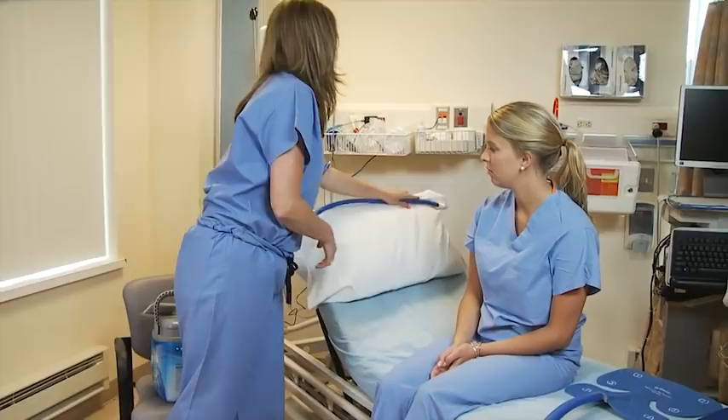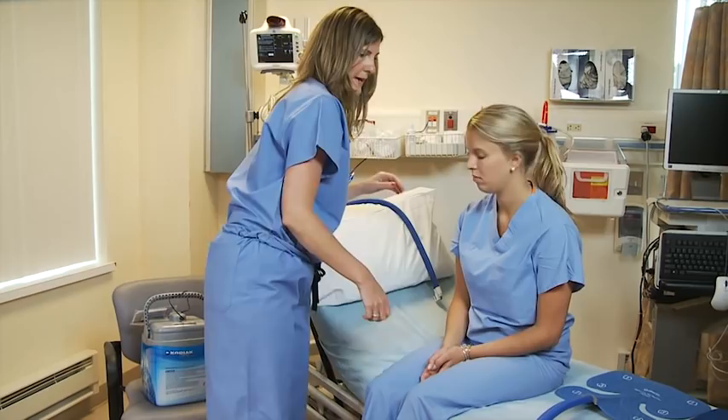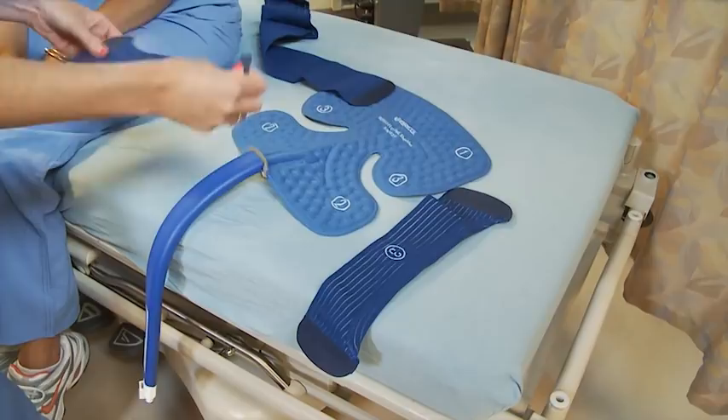Next thing you do, you want to connect this hose which is automatically going to run ice water through the pad. This is the gel pad. Basically you just want to match up the numbers. I'm going to take number one and match it up with number one, then two is going to go right here, and the third one I like to put right down at that point there.